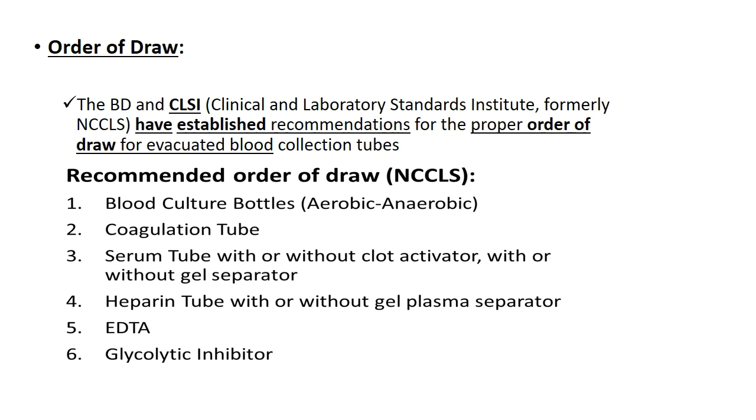Don't take EDTA before the gel tube, because if the EDTA is there in the needle, it will go into the biochemistry gel tube. The EDTA tube actually contains sodium potassium EDTA. So there will be falsely high sodium and potassium, and EDTA will also chelate the calcium in the biochemistry tube. You will get falsely high sodium, potassium, and very low calcium value.